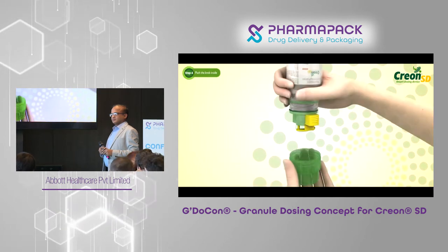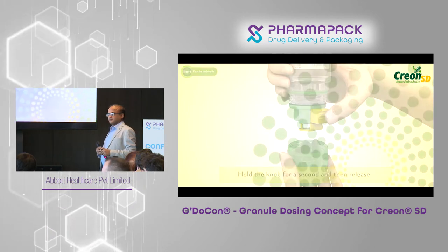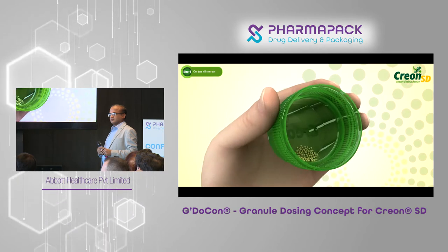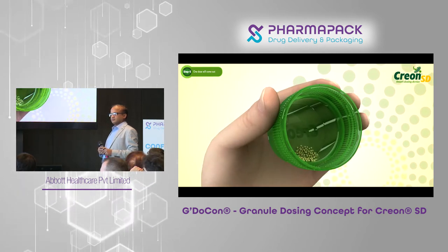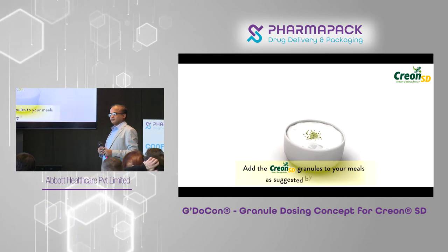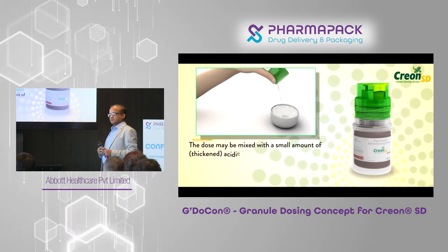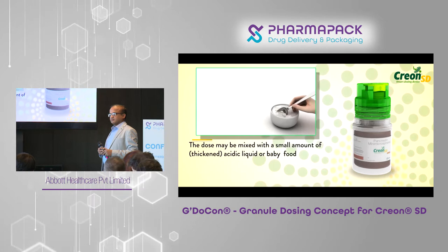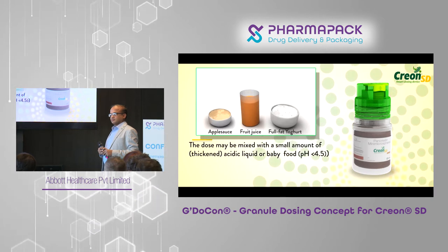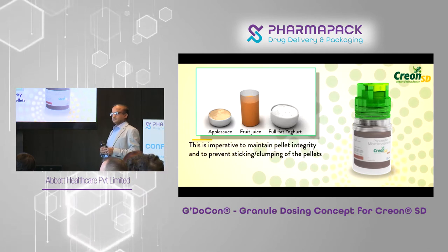Step 4. Push the knob inside. Hold the knob for a second and then release. Step 5. One dose, approximately 250 mg of pancreatic mini microspheres, equivalent to 10,000 IU of lipase, will come out. Add the Creon granules to your meals as suggested by the physician. The dose may be mixed with a small amount of thickened acidic liquid or baby food like full fat yogurt, fruit juice, or apple sauce, pH less than 4.5. This is imperative to maintain pellet integrity and to prevent sticking or clumping of the pellets.